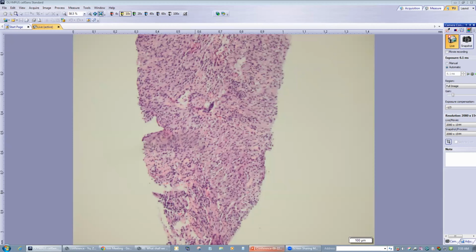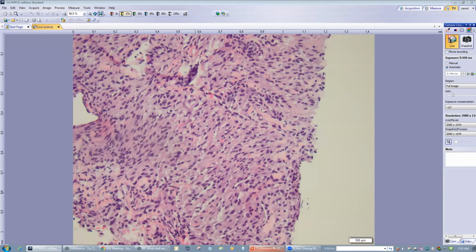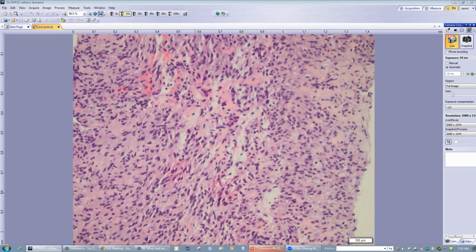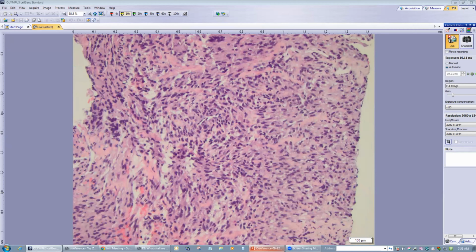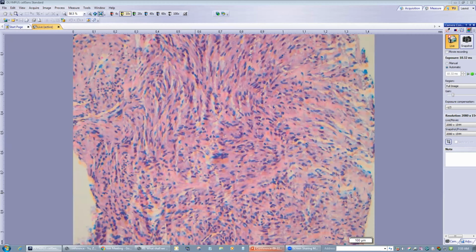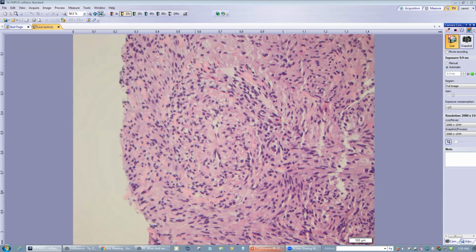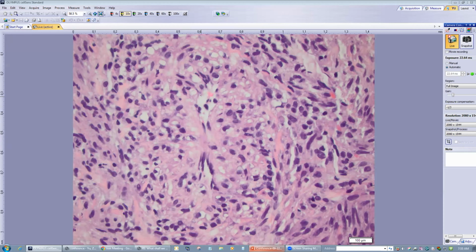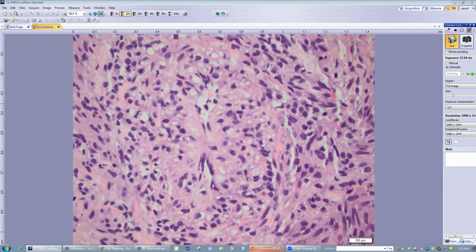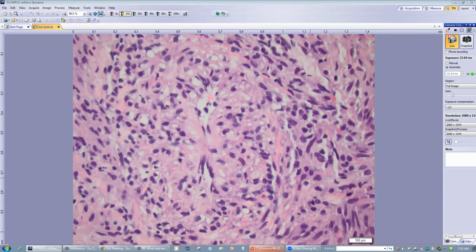So, close look. They are spindle cells. On the biopsy, we did not see much fat. But this is a good vessel. So that's the endothelium, the lumen, thick wall vessel, and smooth muscle transform to the tumor, spindle cell tumor here.